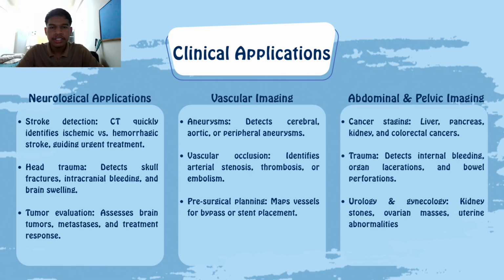And the fourth clinical application is vascular imaging. Aneurysms can be detected, such as cerebral, aortic, or peripheral aneurysms.